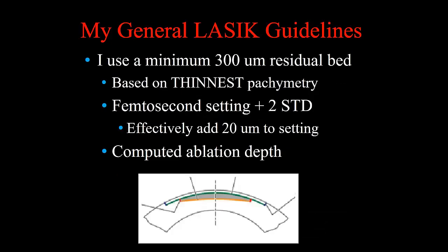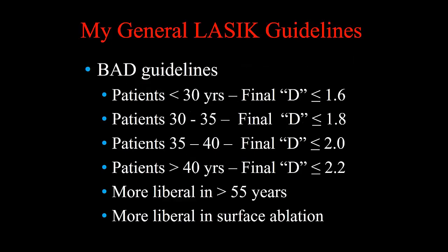I use a minimal 300 micron residual bed, which is based on the thinnest pachymetry, and my femtosecond plus 2 standard deviations, which actually I've cut back a little bit. I won't mention companies, but we switched femtoseconds, and the tolerance, the standard deviations on the one I'm using now seems to be much tighter. And then I use a computed ablation depth.